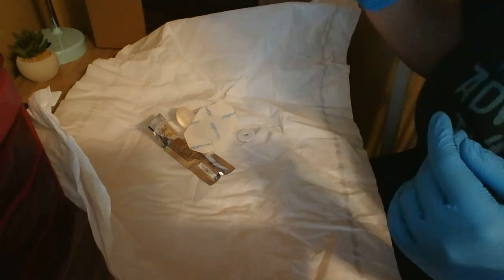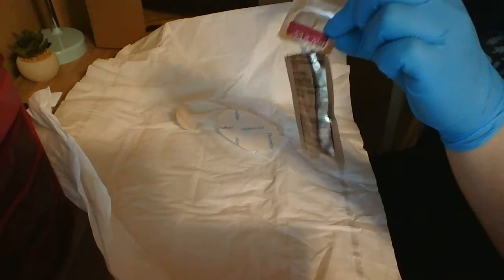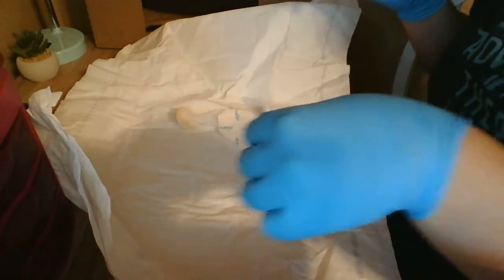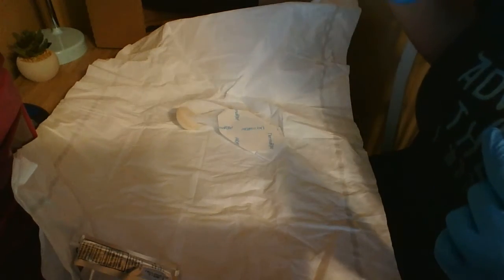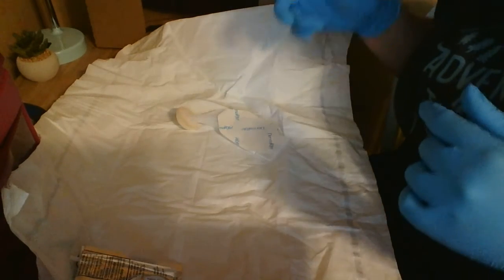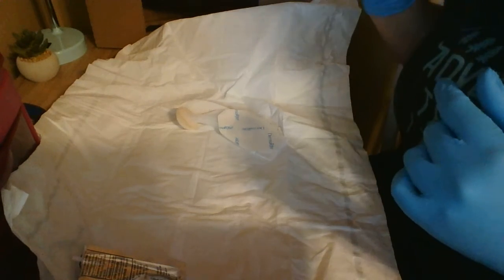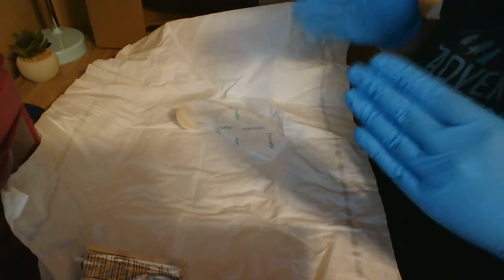Okay, so I would open up my alcohol so I can just take out the swab really quickly. And then I have my other dressing here, and my chlorhexidine swab looking thing. So yeah, so now we're ready to go ahead and do the procedure.